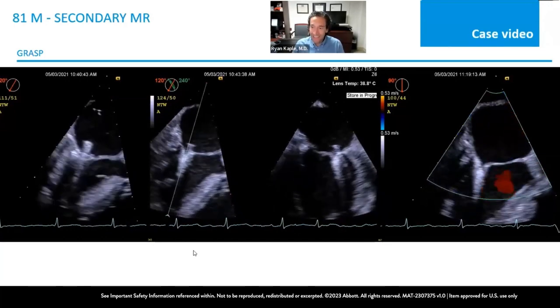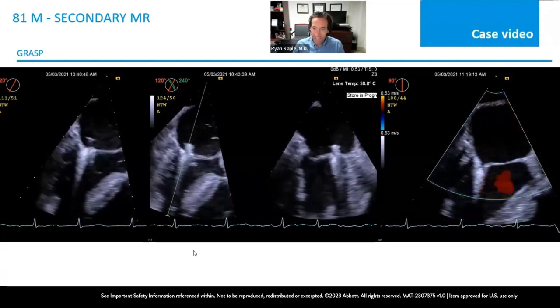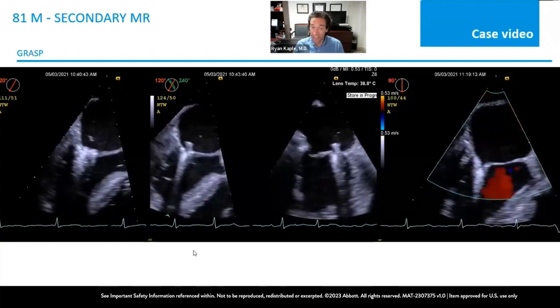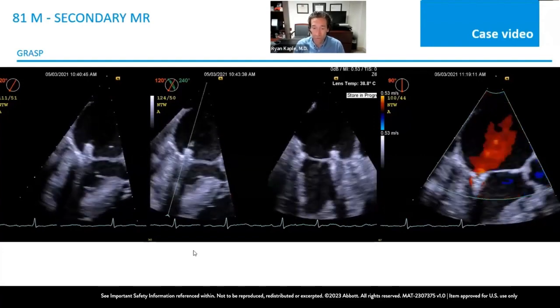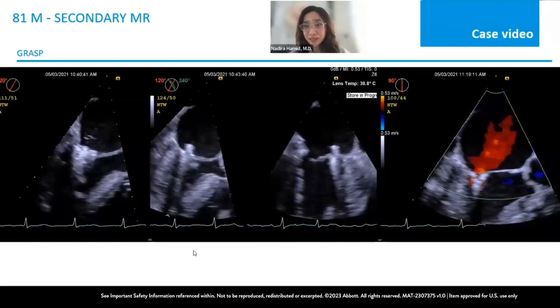And that will affect your ability to get a secure grasp and good leaflet length. So you can gain height and shed height using the knobs. And I think if you're really maxing out those knobs, the anterior and posterior and plus and minus, and you still can't get a good leaflet interaction, then maybe that's the time to do a new transeptal. What do you think, Nadira? That's a tough question. It is, and I completely agree.